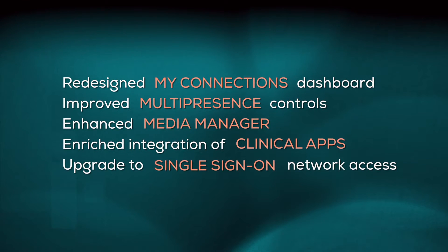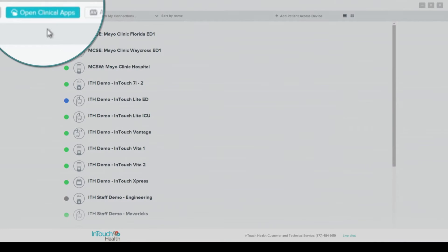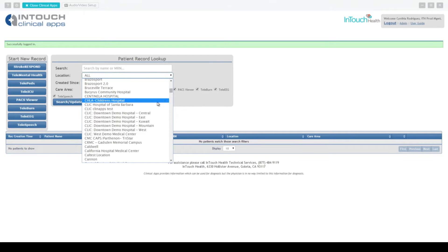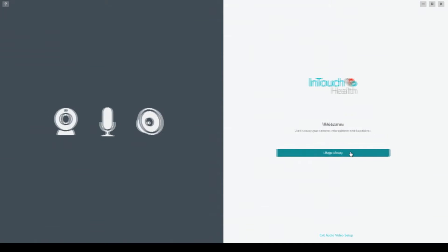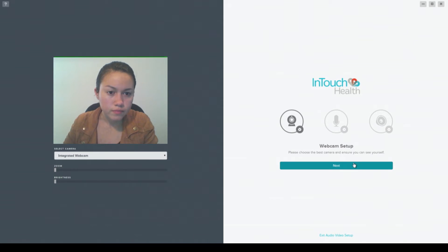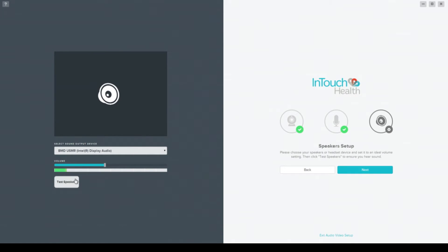You can launch clinical apps before a consult to create, view, and edit patient records and imagery. Now you can easily go through and check your microphone, video, and speakers before a session — this is a test of your speakers.